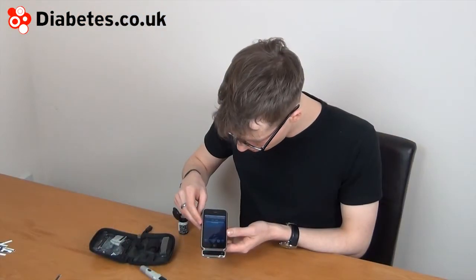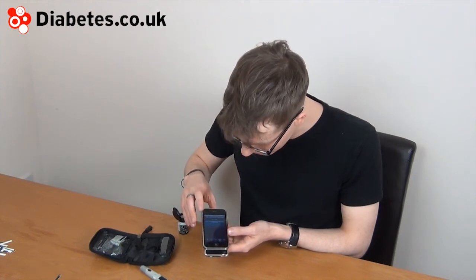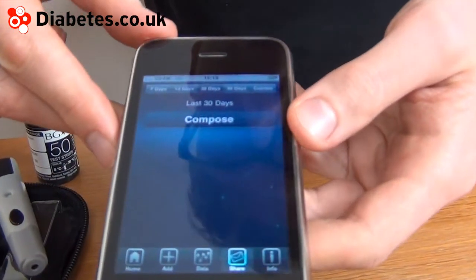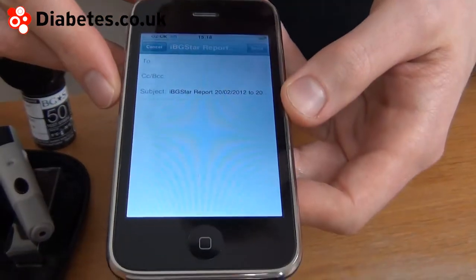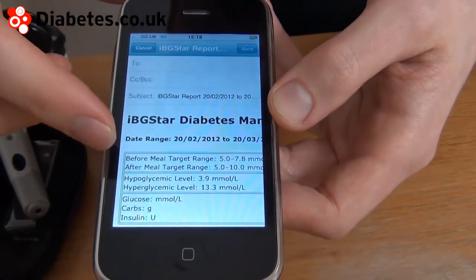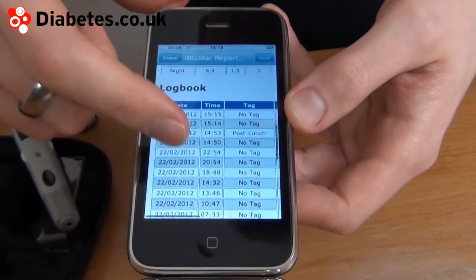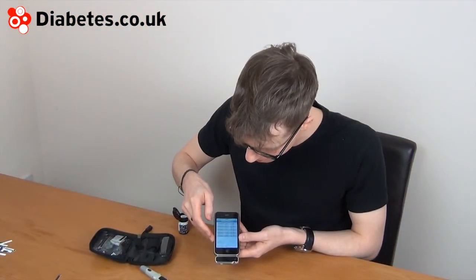The next feature to show is the share functionality. You can actually email yourself or your doctor with the results you've had. We'll compose an email — you can set the number of days that it pulls data from. It even includes a CSV file, which means you can open your readings in a spreadsheet such as Excel.